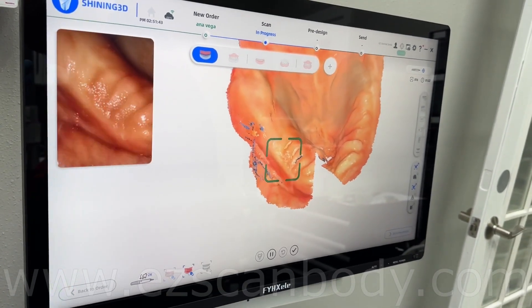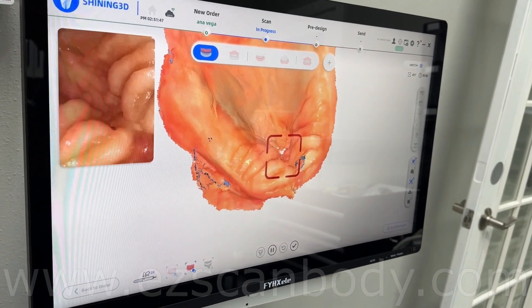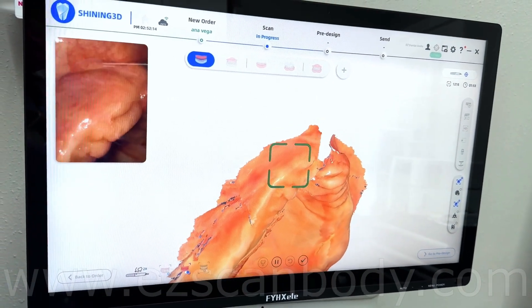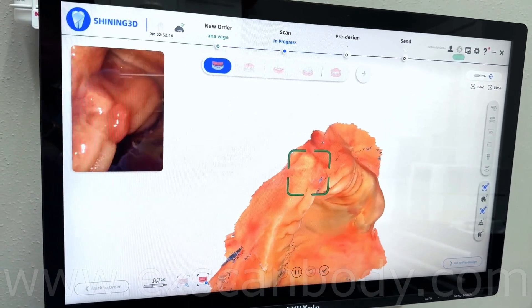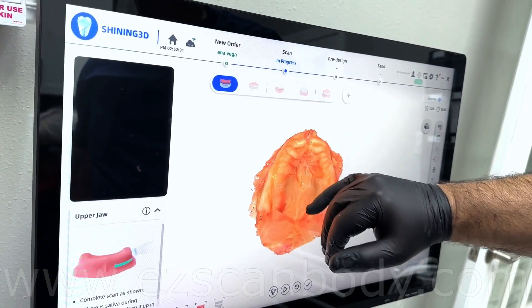Follow the scan protocol suggested by the scanner. Start from one side and continue to the other side continuously. Always scan part of the already-scanned area with the new area. If you jump, the scanner may overlap the scan. Check all the scans and if you see any problems, wipe and re-scan it.